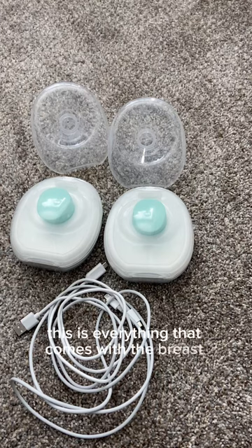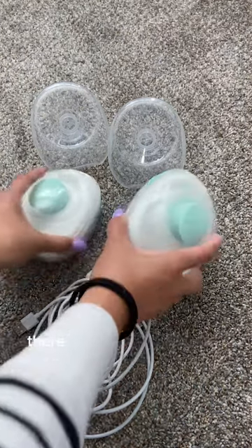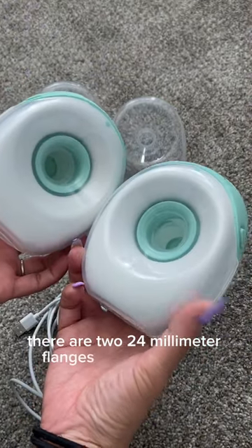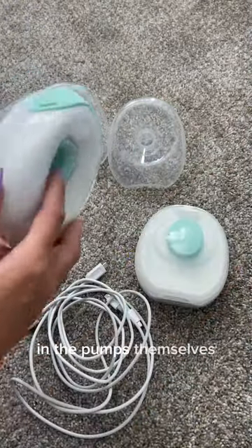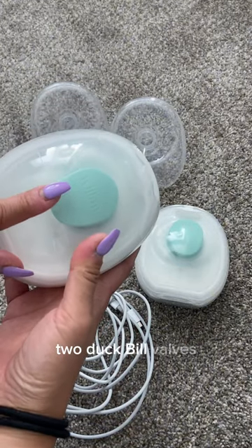This is everything that comes with the breast pumps. There are two 21-millimeter flanges, two 24-millimeter flanges that I have here in the pumps themselves, and the two pumps and two duckbill valves.